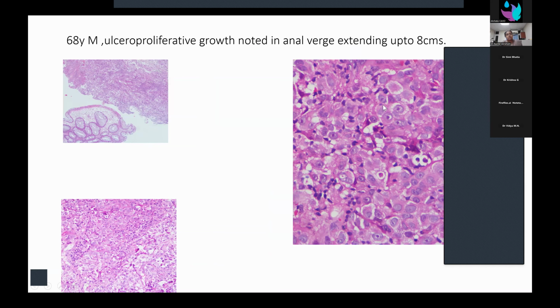The tumor was composed of sheets and groups of very large polygonal cells having eosinophilic cytoplasm and very prominent inclusion-like eosinophilic nucleoli, and the stroma was scanty with only some mild lymphoplasmacytic infiltrate. We did not see any glandular pattern in the tumor or a neuroendocrine morphology.